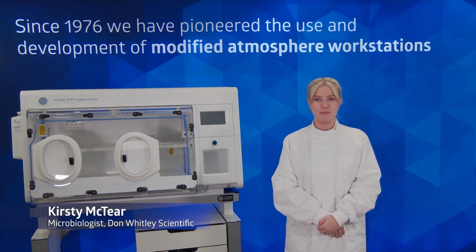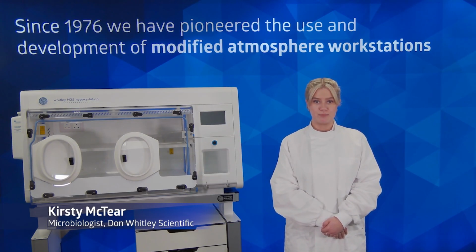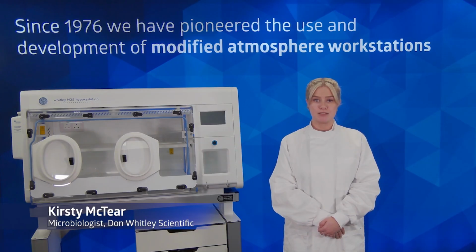His work focuses on the laboratory analysis of anaerobic pathogens and the application of modern genomic tools to better understand these organisms. At the UK Anaerobe Reference Unit, whole genome sequencing is increasingly used to support the identification and surveillance of anaerobic bacteria, as well as the investigation of antimicrobial resistance and potential transmission events. Historically, techniques such as ribotyping were used to analyse bacterial genomes, but whole genome sequencing now provides a far deeper insight, enabling improved transmission tracking, uncovering hidden outbreaks, and enhanced monitoring of antimicrobial resistance.